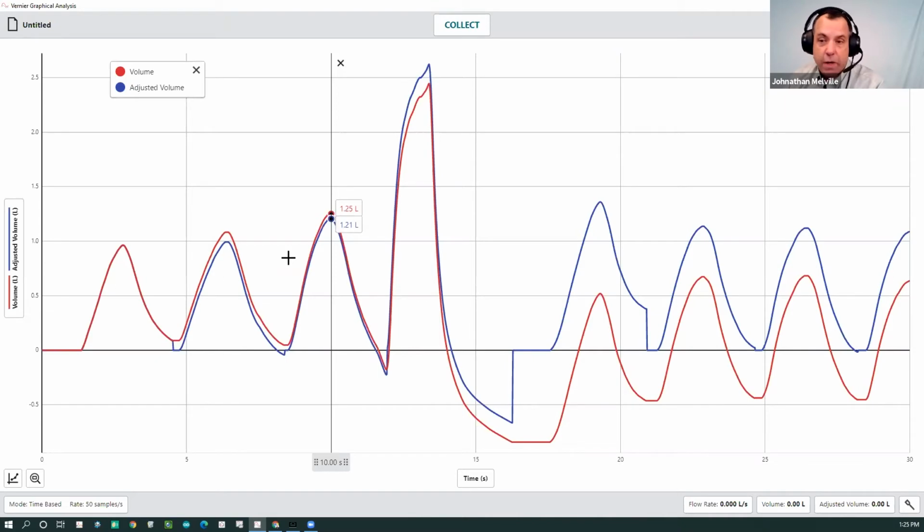But the average tidal volume for most individuals, and this is normally college-age men that they give these numbers for, is about ½ a liter. So I'm breathing quite a bit more here than you would normally expect. That isn't a big deal for getting the idea behind this lab. You could have someone just practice breathing and you will see that they will breathe in a more normal way.